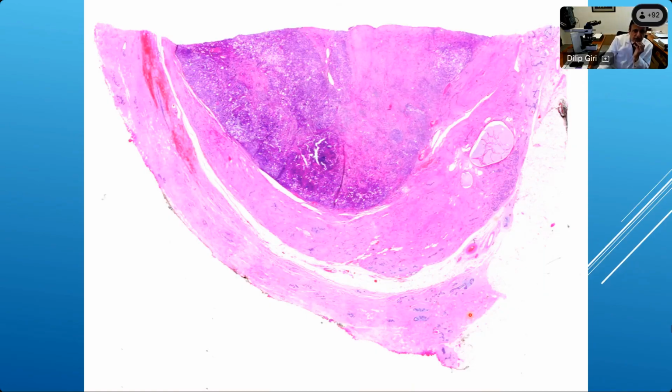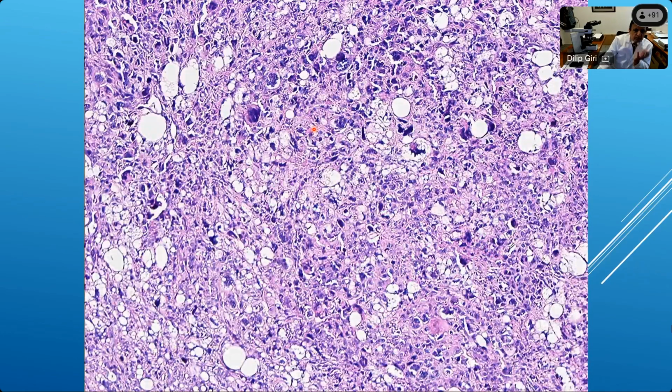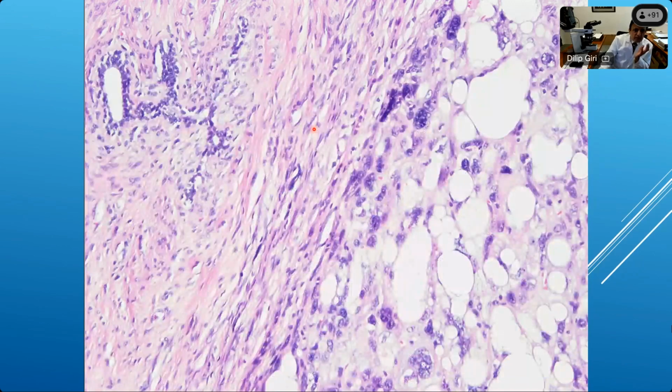So although the heart of the lesion may be something like this, which would be like a pleomorphic sarcoma, the periphery of it may begin to look something like this. So here you have an immediate transition from the highly malignant looking areas to now something not as bad looking, and perhaps looking even benign, because only the benign portions were sampled.